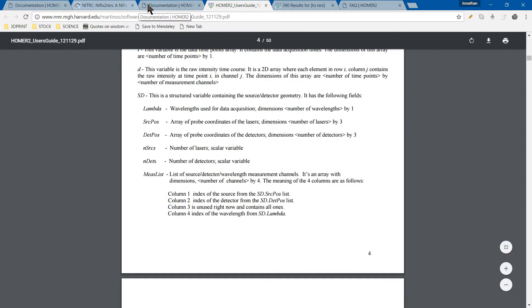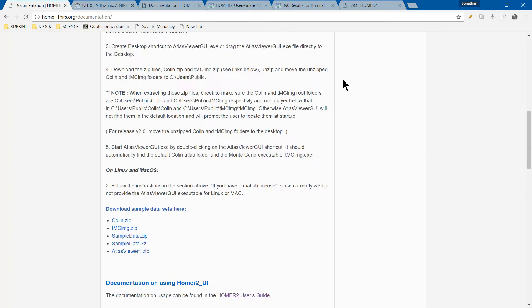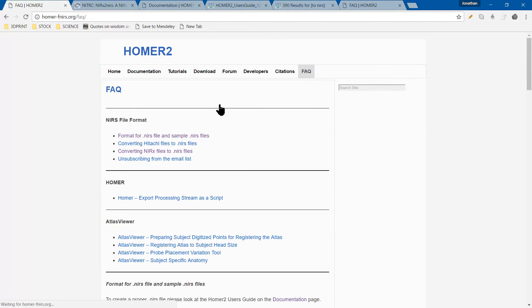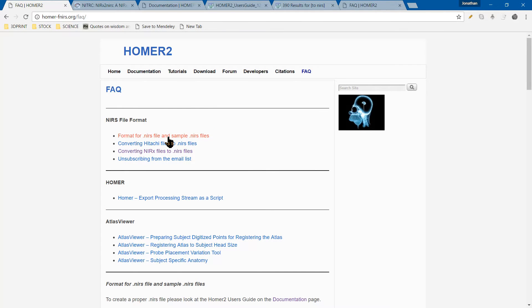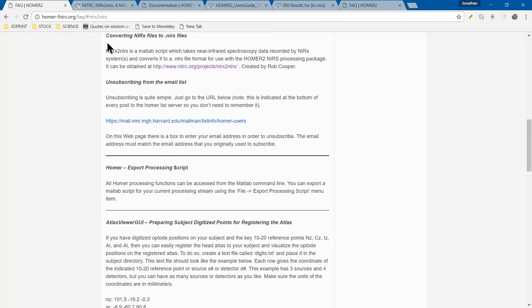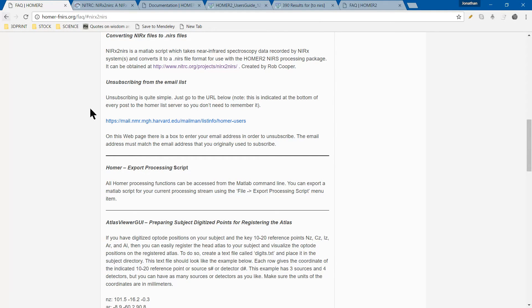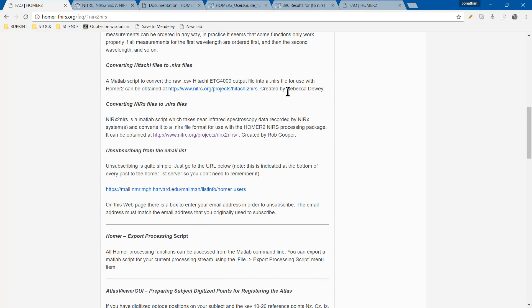From there, if you go back to the FAQ, here you'll actually find where the NIRx and NIRS files are. We use NIRx. There's also one for Hitachi. The Hitachi code was written by Rebecca Dewey at Nottingham, and the NIRx was written by Rob Cooper at University of California.